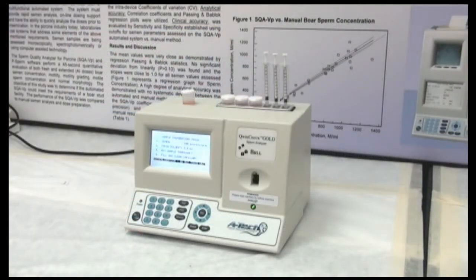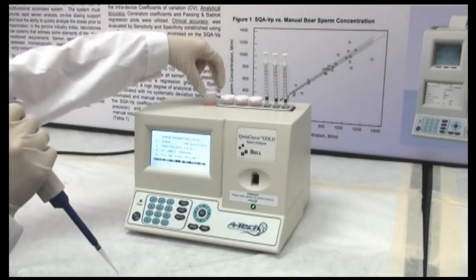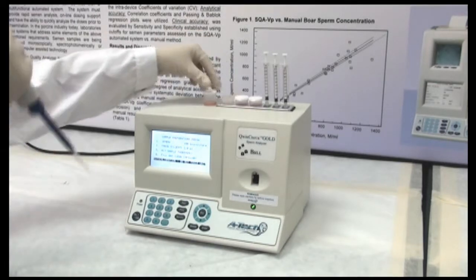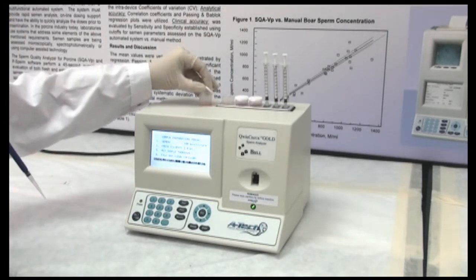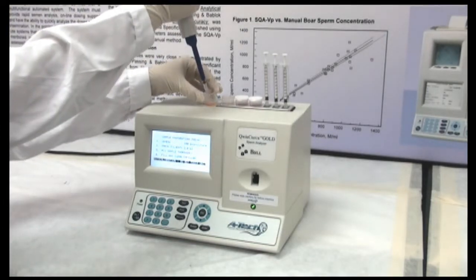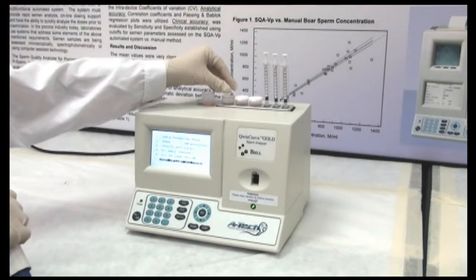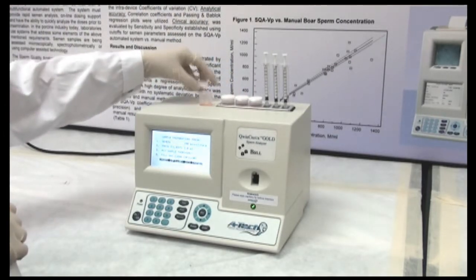The system will go through a quick stabilization before each sample and beep at you when it is ready to analyze. During this time, go ahead and make your dilution. In this example, the cup outside the heating dock represents the semen sample. Of course, in practice, you will probably pull the sample straight from the semen collection bag.